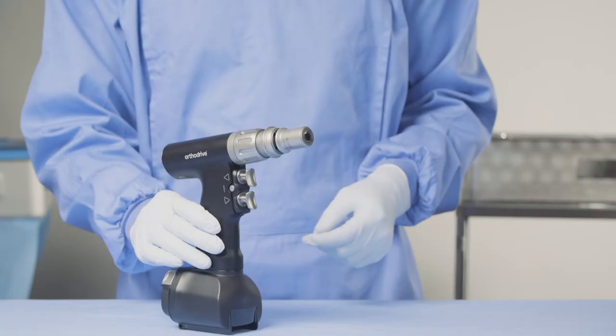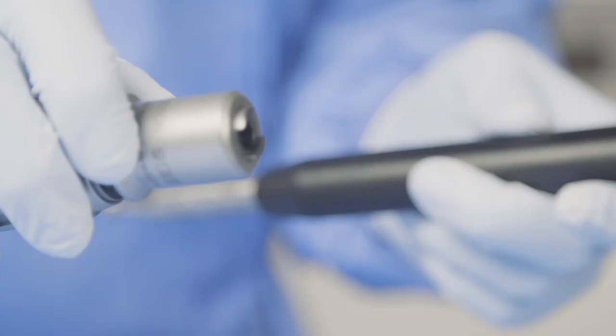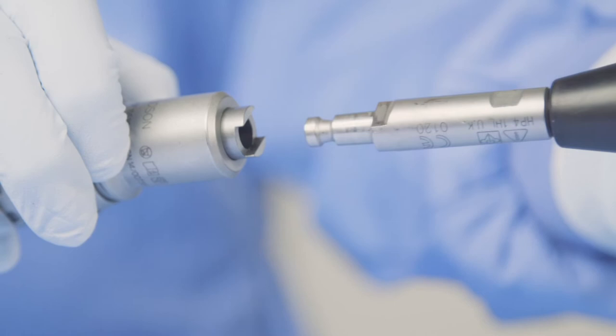Then you want to take an appropriate reaming handle, such as this one, and to attach, simply pull back on the Hudson collar and slide the reaming handle into place. Release the collar to lock.